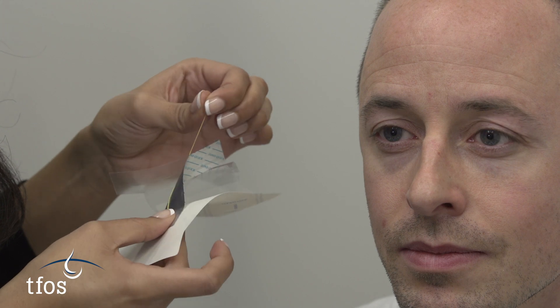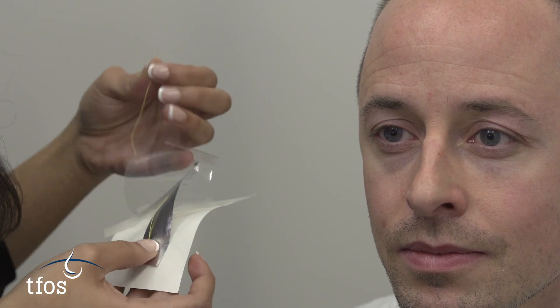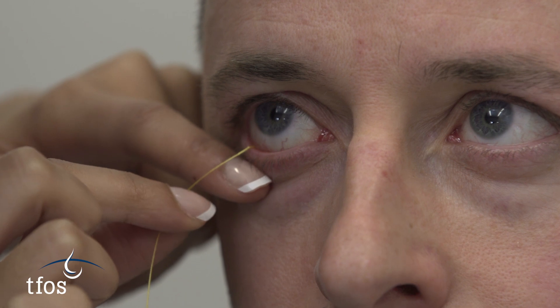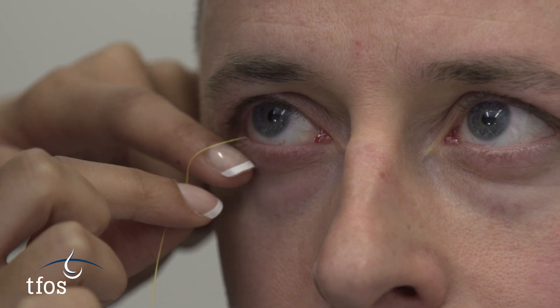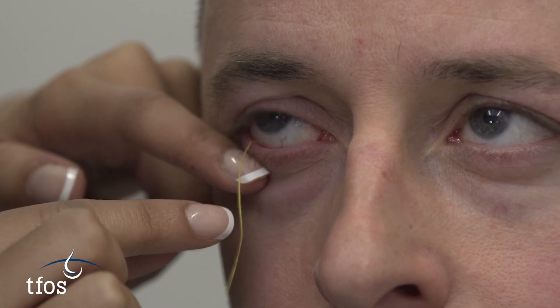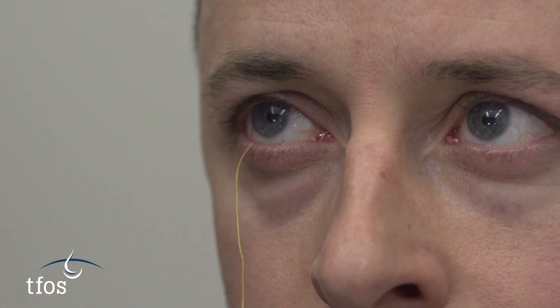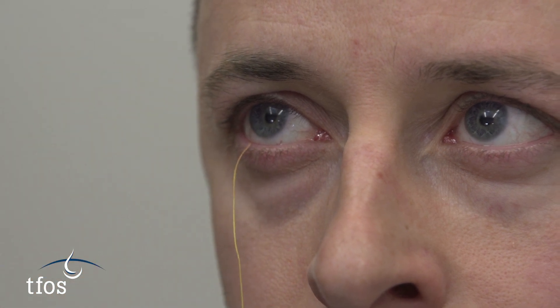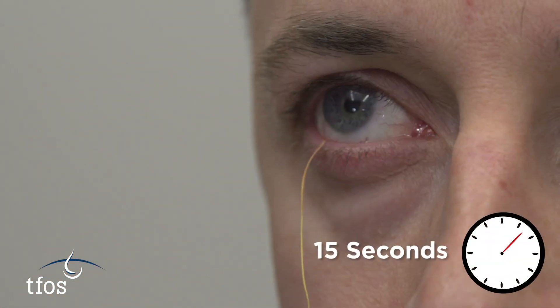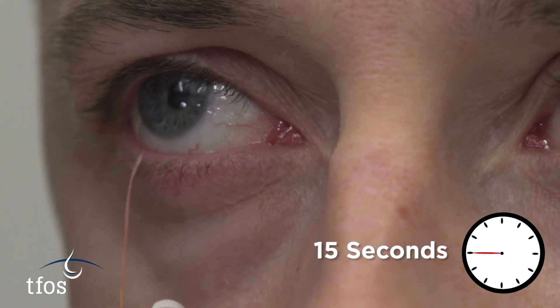The phenyl red test is a less invasive alternative to the Schirmer test, using pH-sensitive cotton thread rather than filter paper. The hooked end of the thread is placed over the lower lid margin, again in the lateral third, and is left in place for only 15 seconds before measurement.